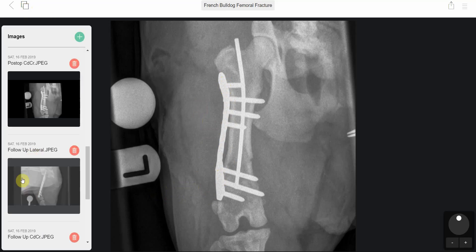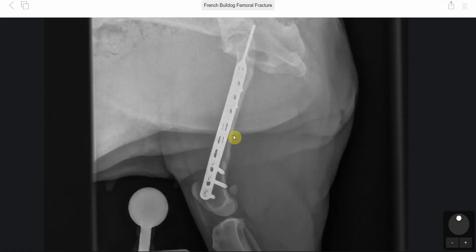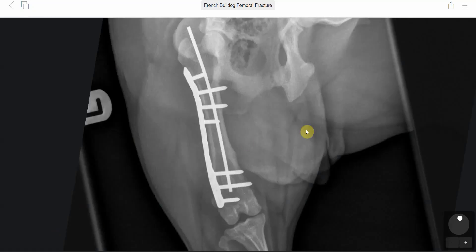Follow-up x-rays taken at around eight weeks post-op showed good healing of the femoral fracture, with a lot of remodeling, good bone healing, and no implant loosening or issues with impingement of the stifle. On the caudal cranial view, again, good healing of the fracture, no implant loosening, and no issues were apparent.